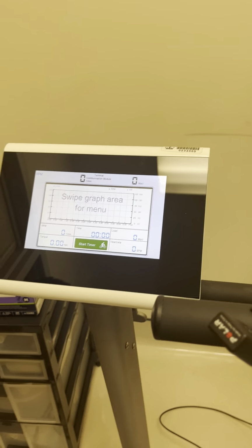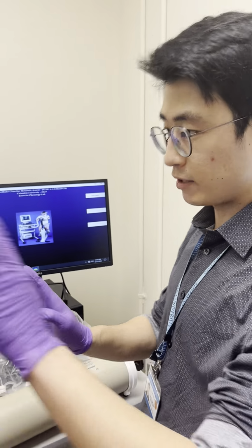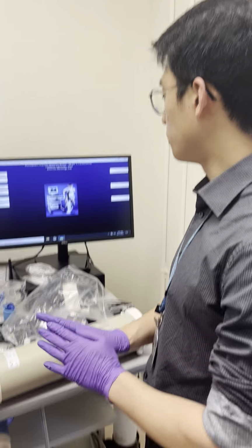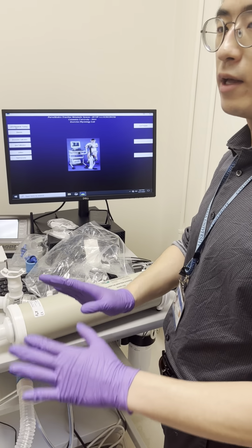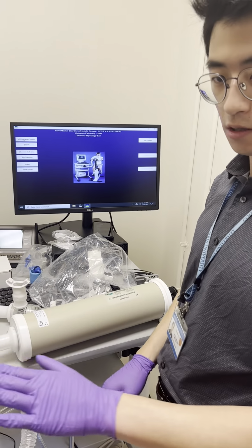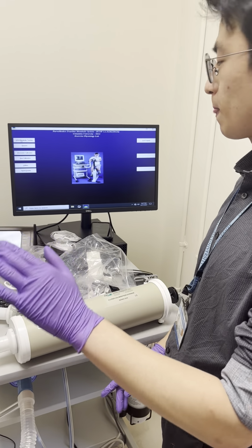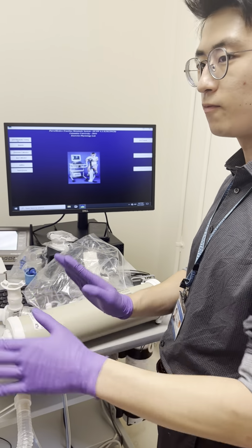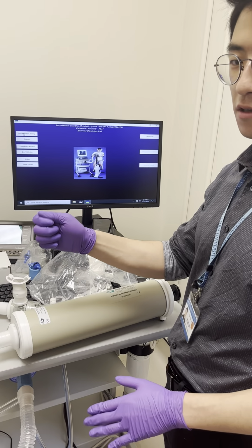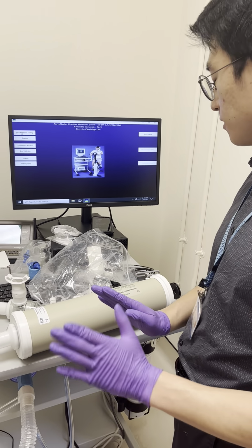And then, as we go through the procedure, you'll see the point at which it makes sure that the bike is connected. Just so that you can make a note for yourself. You might want to do that once at the beginning of the day before anyone comes in, just to make sure that the bike is connected. Last time what happened was the bike wasn't connecting. It was like COM4, like some file was missing. I just unplugged and replugged the USB and it worked. So the stuff can be a little finicky.